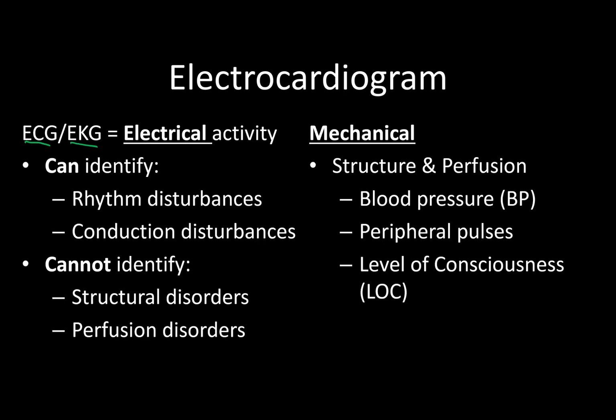All that you can do with an EKG is identify rhythm disturbances and conduction disturbances. You cannot identify if there's a specific structural problem or if there's a perfusion issue, because those are mechanical. Structure and perfusion, that's your blood pressure, your pulses, and even your patient's level of consciousness.